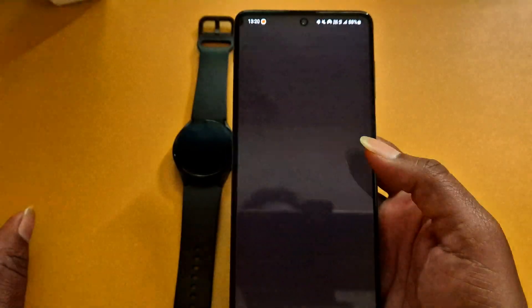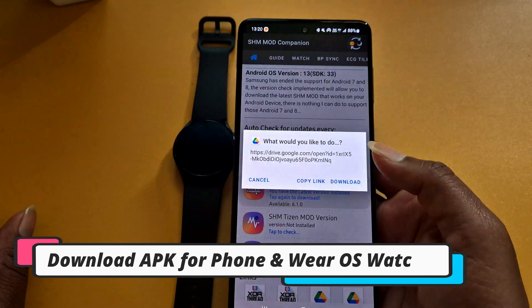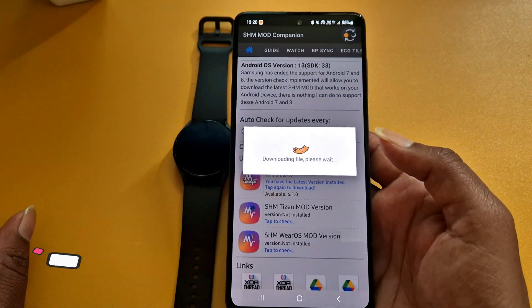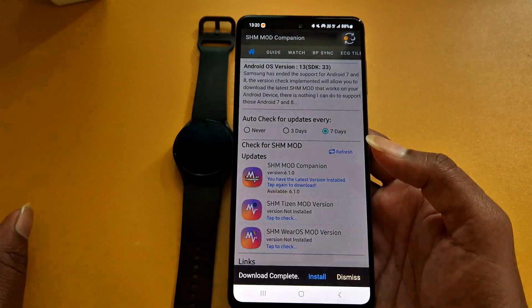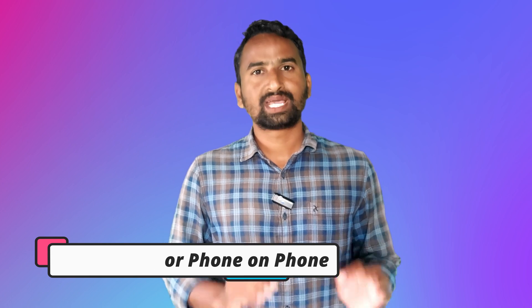Open the SHM Mode app and download two APK files — one for smartphone and one for Wear OS watch. Just ignore the APK for Tizen OS and download the remaining two. After downloading, install the APK file for smartphone first.